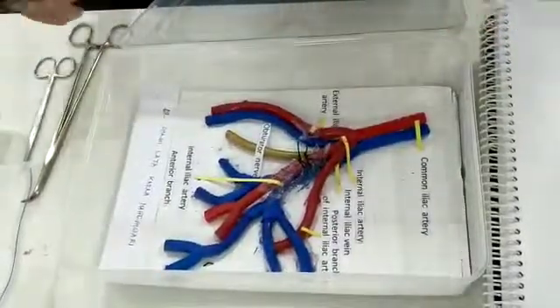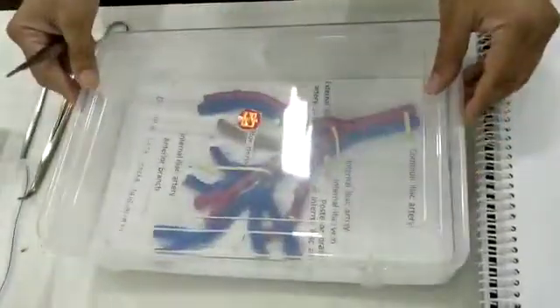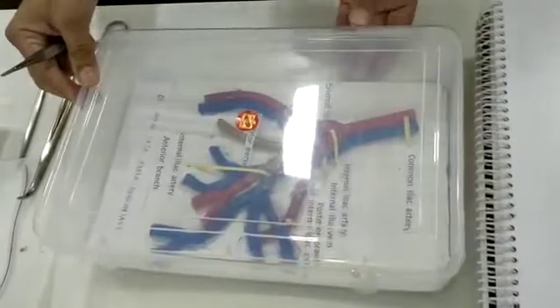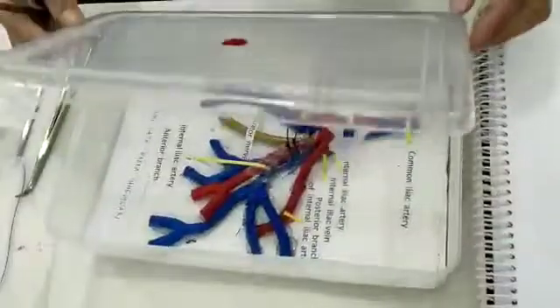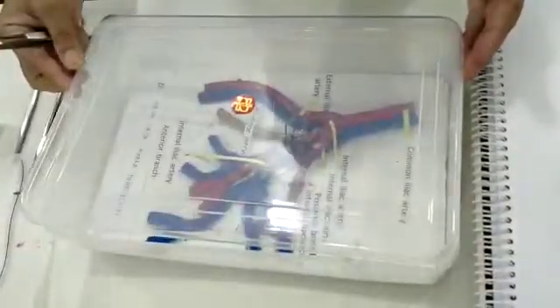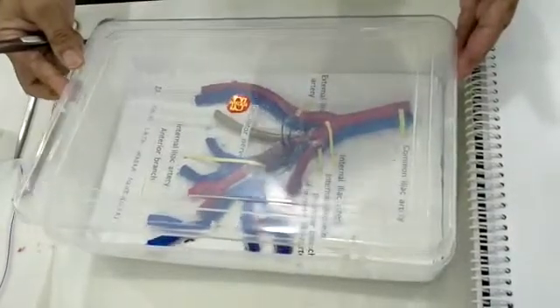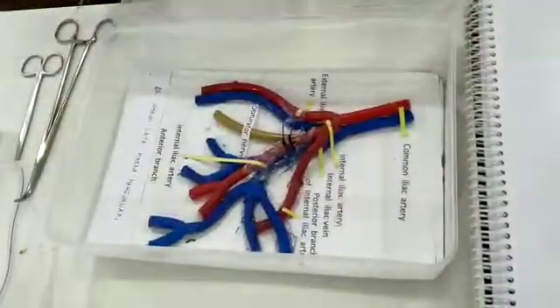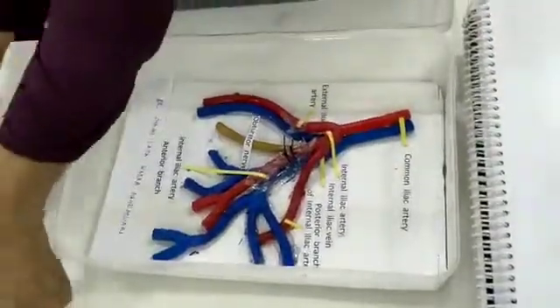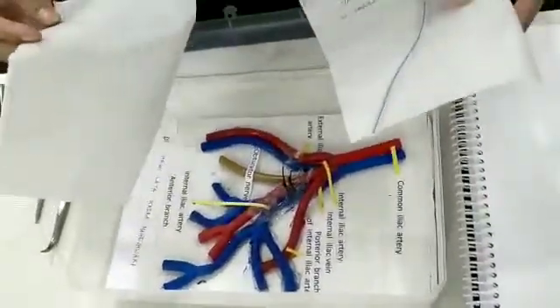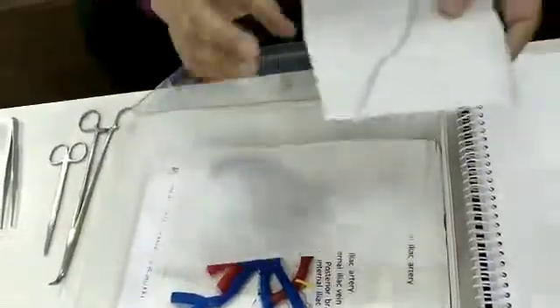This is the model which I made. It is a plastic box with a depth of around five inches. It has a cover so it is very easy to carry for me, and I can take it any place for a working demo. These two represent retroperitoneal flaps - this is the lateral flap and this is the medial flap which has the ureter. The ureter always goes in the medial flap.